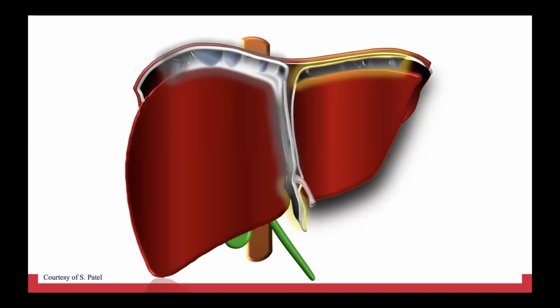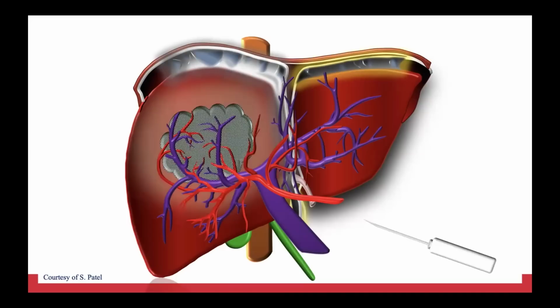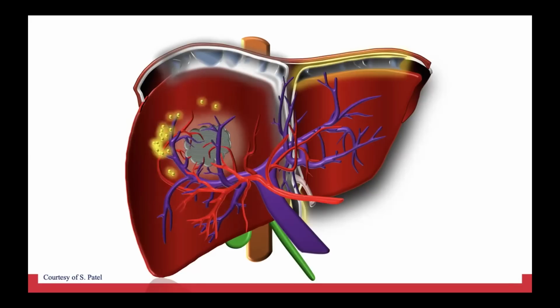For those of you who may not be familiar with interventional treatments, this is a cartoon that shows how transarterial therapy gets done. A lot of primary cancers are supplied by the hepatic artery, not so much by the portal vein. So we use that anatomical characteristic, where such blood supply can be localized from the hepatic artery, and whichever treatment medium, whether it's Y90 radioembolization, chemoembolization, or bland embolization, and so on, all of these materials get infused or administered directly to the tumor vascular bed so that the tumor can respond. This is basically the same concept for all of the transarterial therapies.